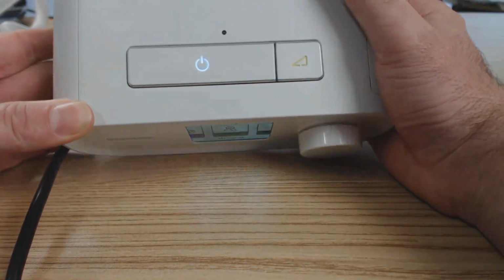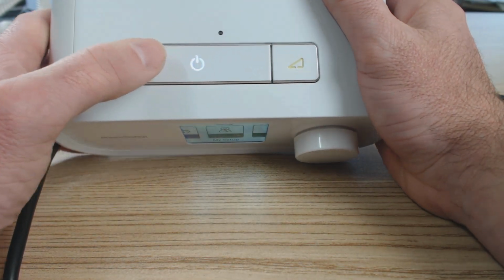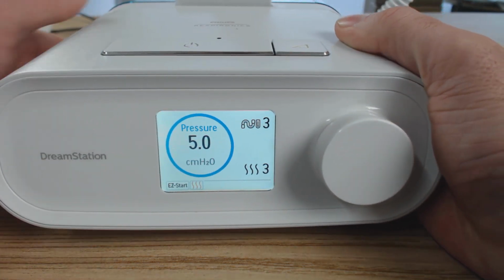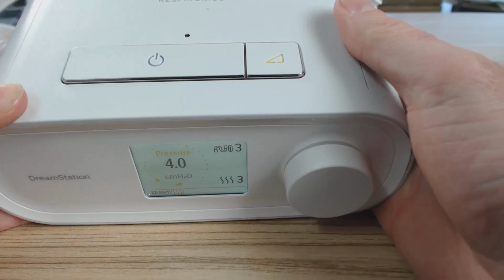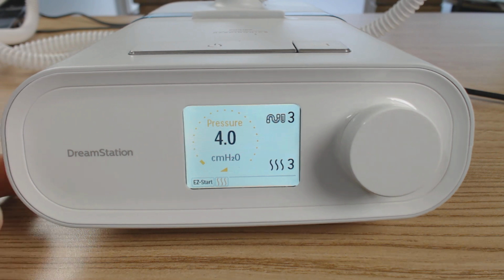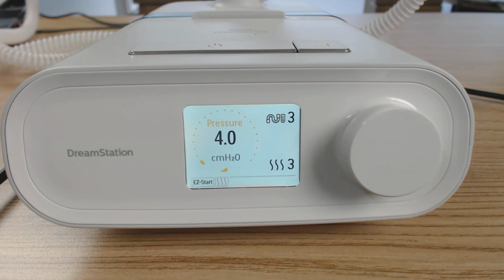On the top of the device here, you've got your on button. If your machine hasn't been set to automatic on, you can click this button. So if we click this button here, you can see that it's turned on now. And we've also got a ramp button on the top here that we can press as well, okay? Alright, so the ramp there is now 4, and it will gradually increase up to, I think this machine's set to 5, so it'll go 4.1, 4.2, 4.3, and gradually increase that ramp up to that fixed pressure because it's a fixed pressure machine.